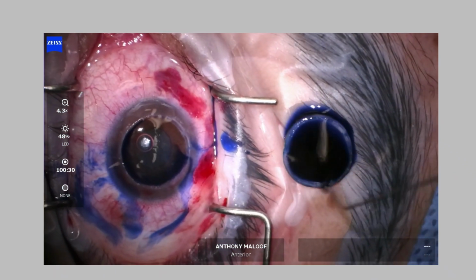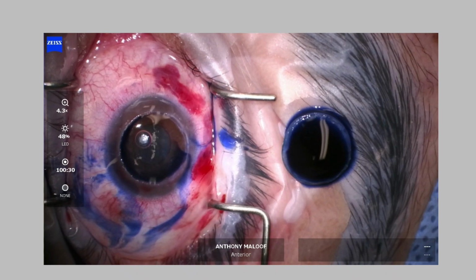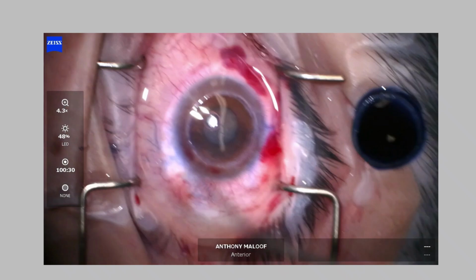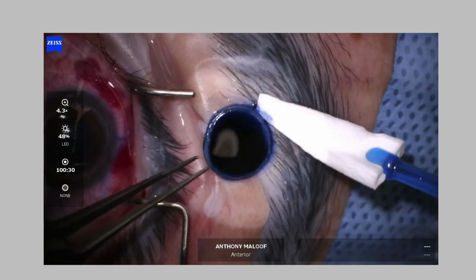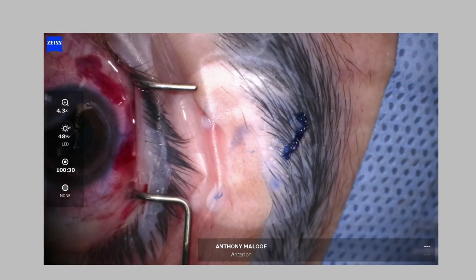Not something I intend to do, but it won't harm. I use a double staining approach, so I put some down, and then this is not a really good quality cornea. Endothelial cells aren't happy, so look how beautifully the endothelium stains. It goes bright blue. I'm glad I didn't have to use this for a full transplant. And here we go.